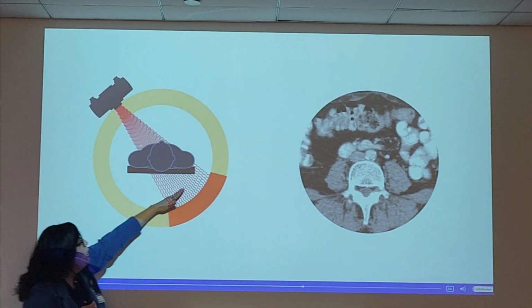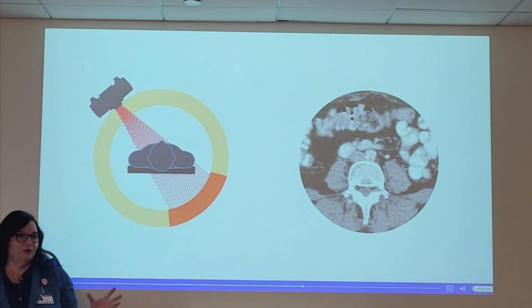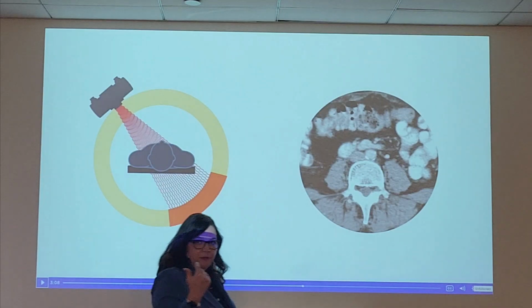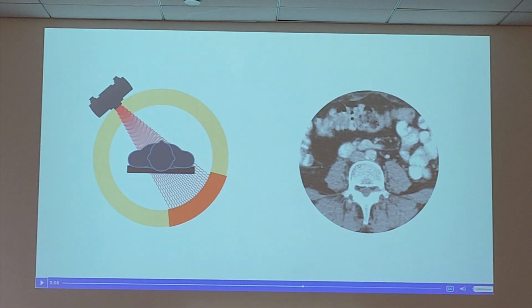The intensity of all of these beams, right? Because intensity means quantity. Remember, we're talking about mA. Milliamperage and time talks about how many X-rays are released from the X-ray tube, but the energy is how high the energy is. Is it 90 kVp? Is it 100 kVp? Is it 125 kVp? That's the energy. Intensity means quantity. Energy means the punch.